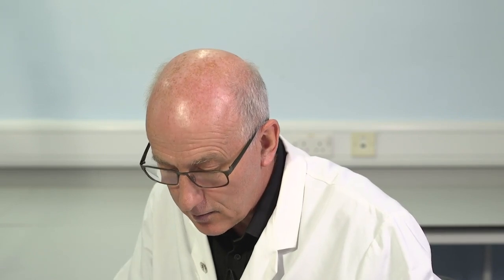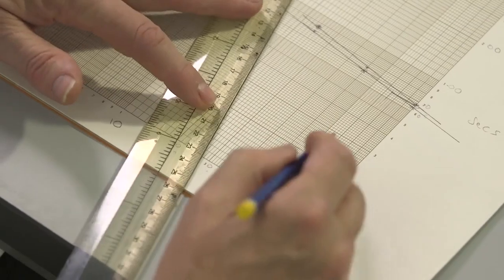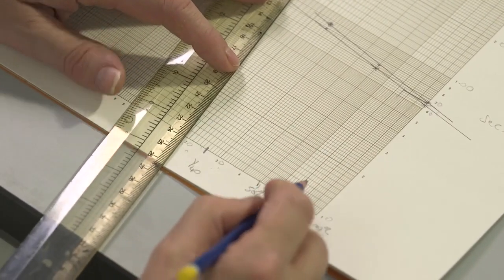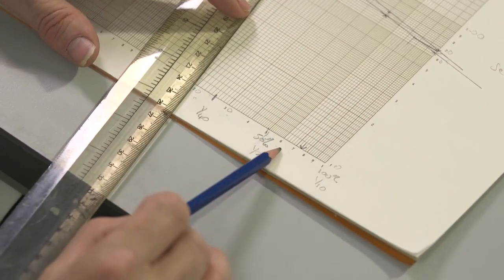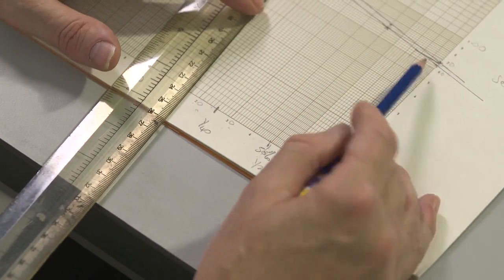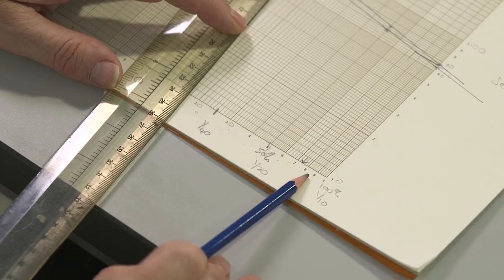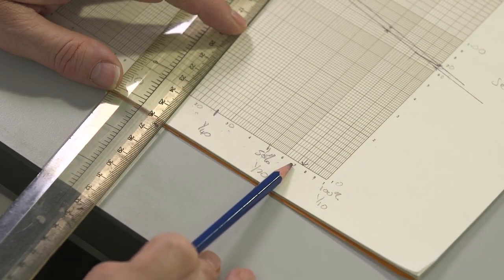And then we drop a perpendicular and ask the question, what's the concentration of standard which would have given that clotting time? 100%, 90%, 80%, 70%.